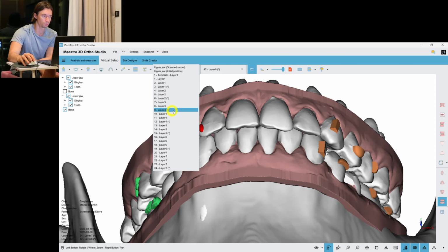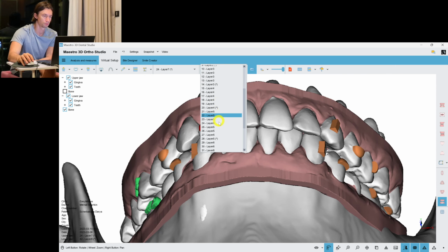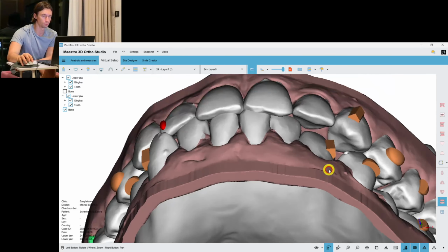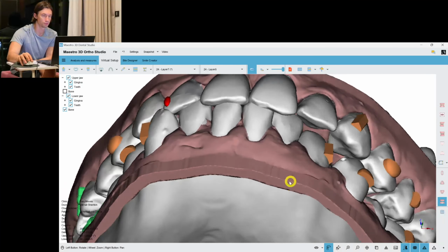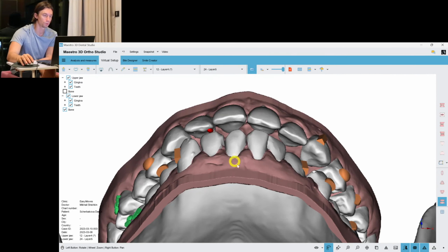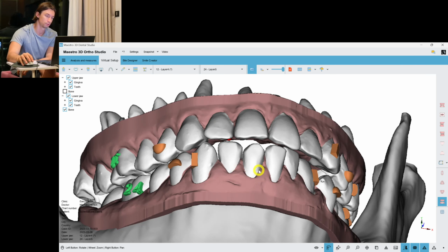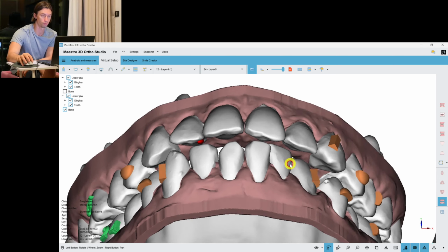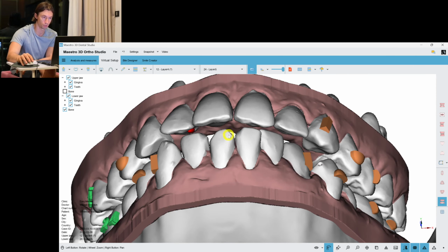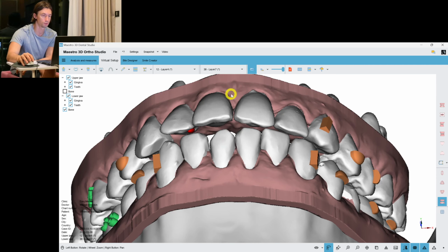We'll have to synchronize the movements, because if the patient is wearing the aligners simultaneously, he'll finish the upper jaw treatment at aligner 24, but the lower jaw aligner 24 sets the teeth to the proclined position. So we'll ask the patient to, let's say, change the aligners maybe once a week for the lower jaw and once in 2 weeks for the upper jaw, something like this. So the movements go more synchronized, more simultaneously, and there is always some sagittal gap so that the lower teeth can expand, because they expand until aligner 35 or even 38.